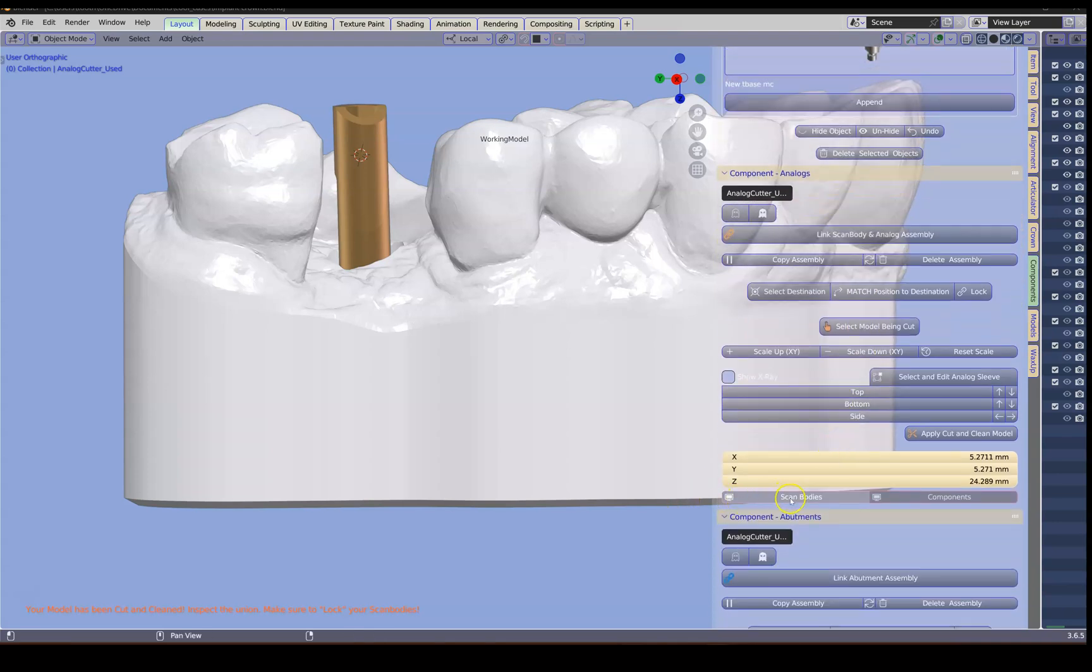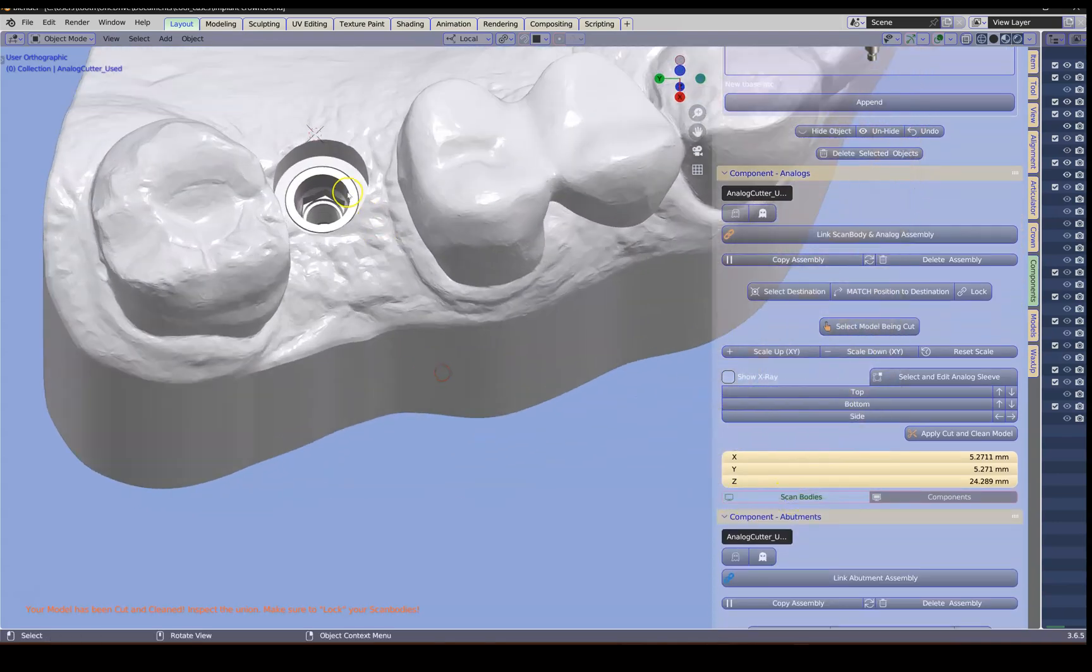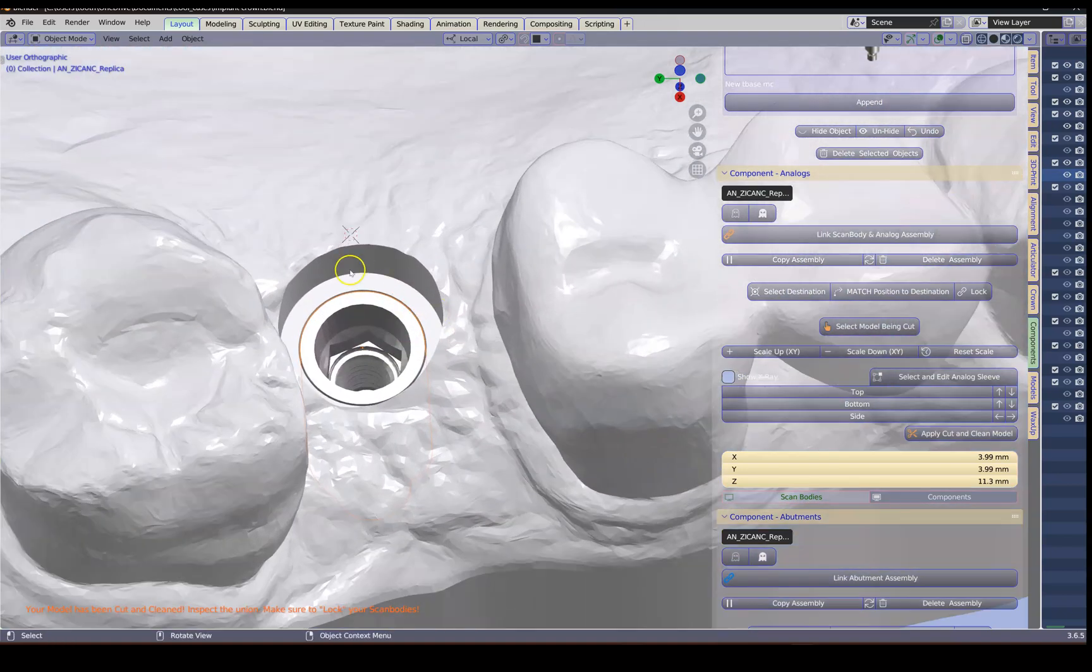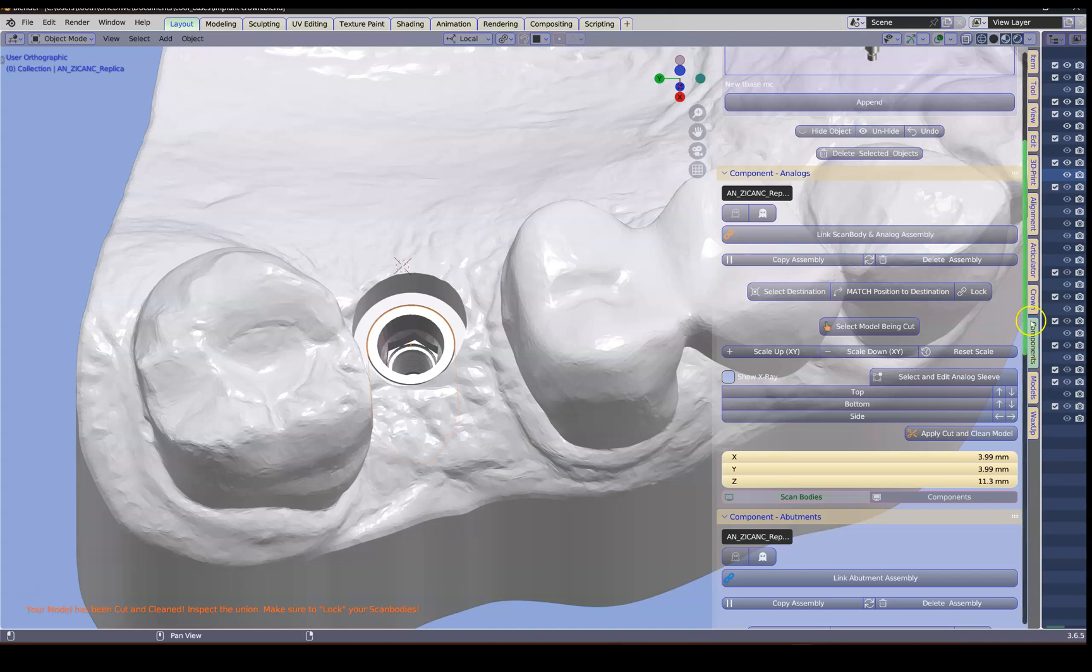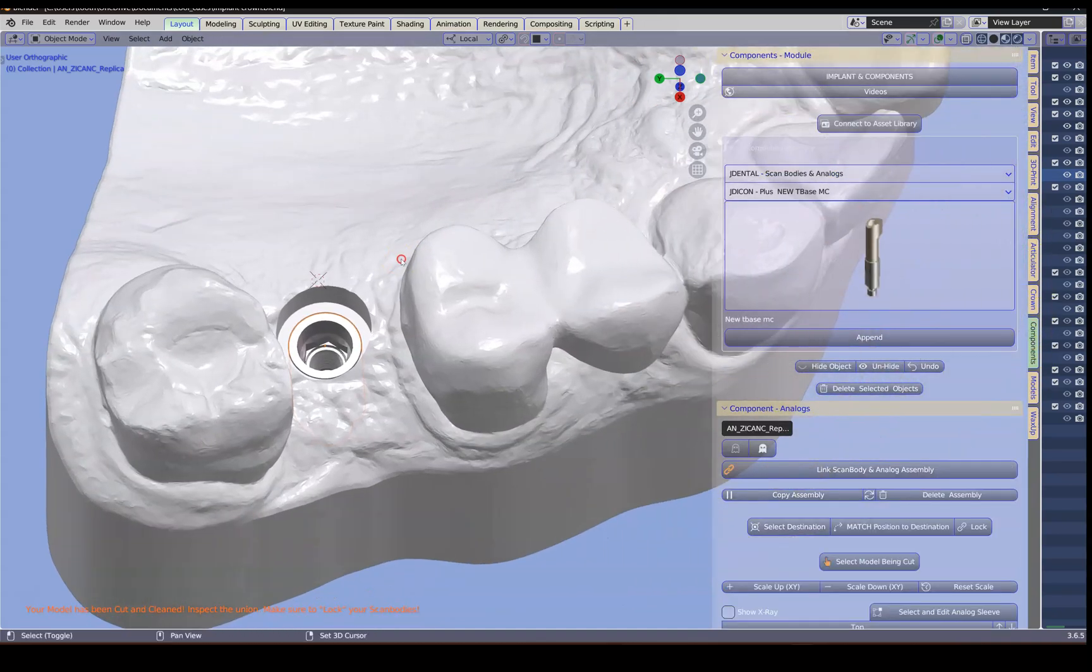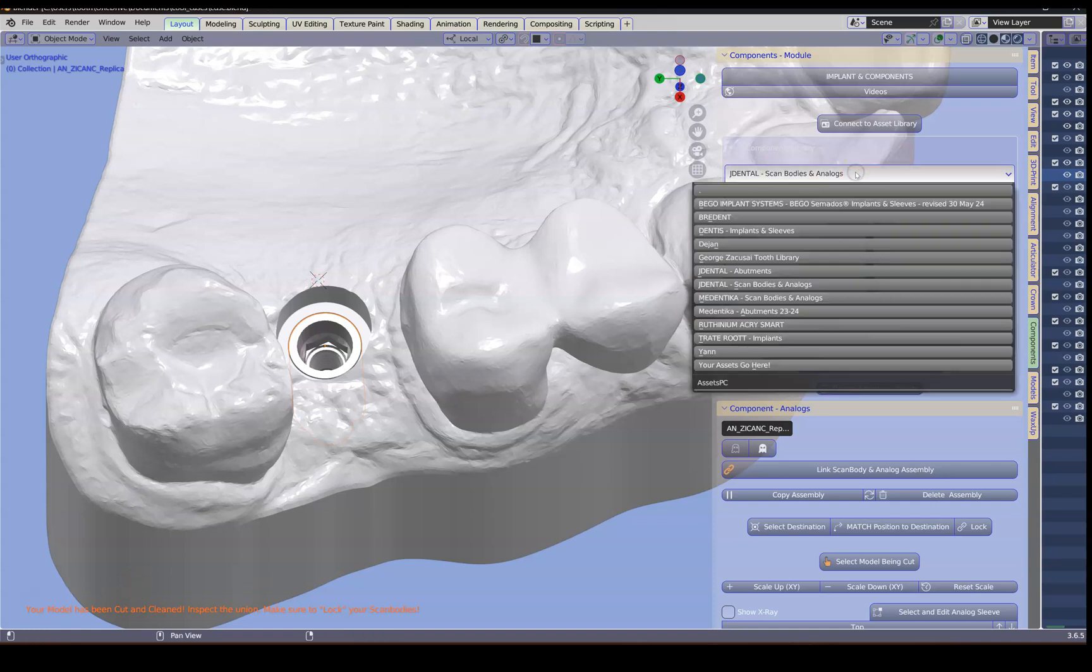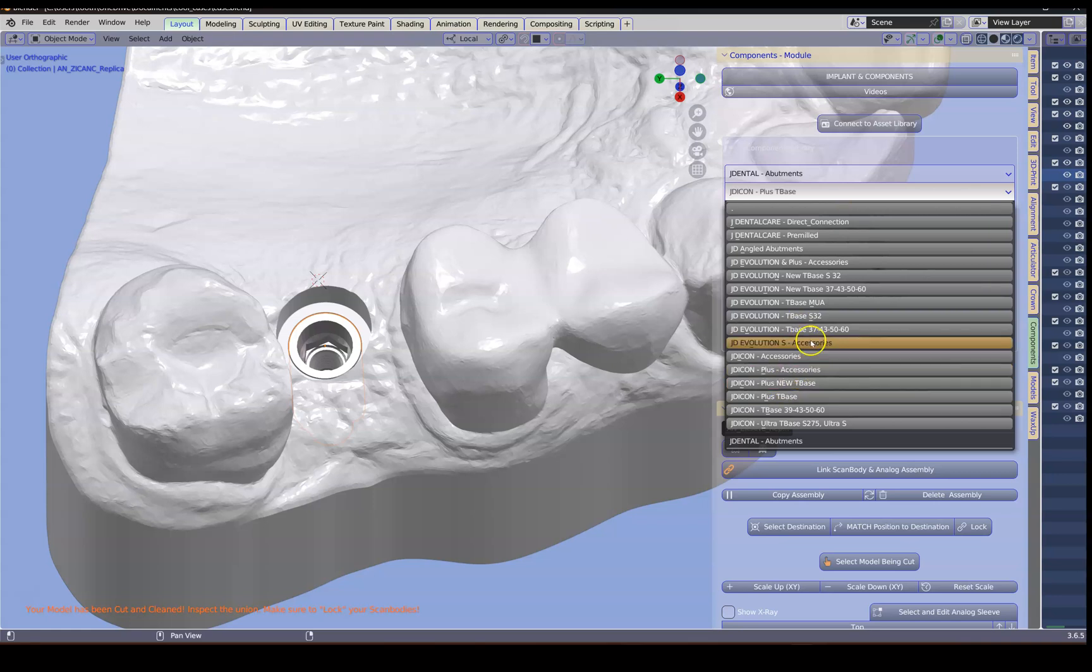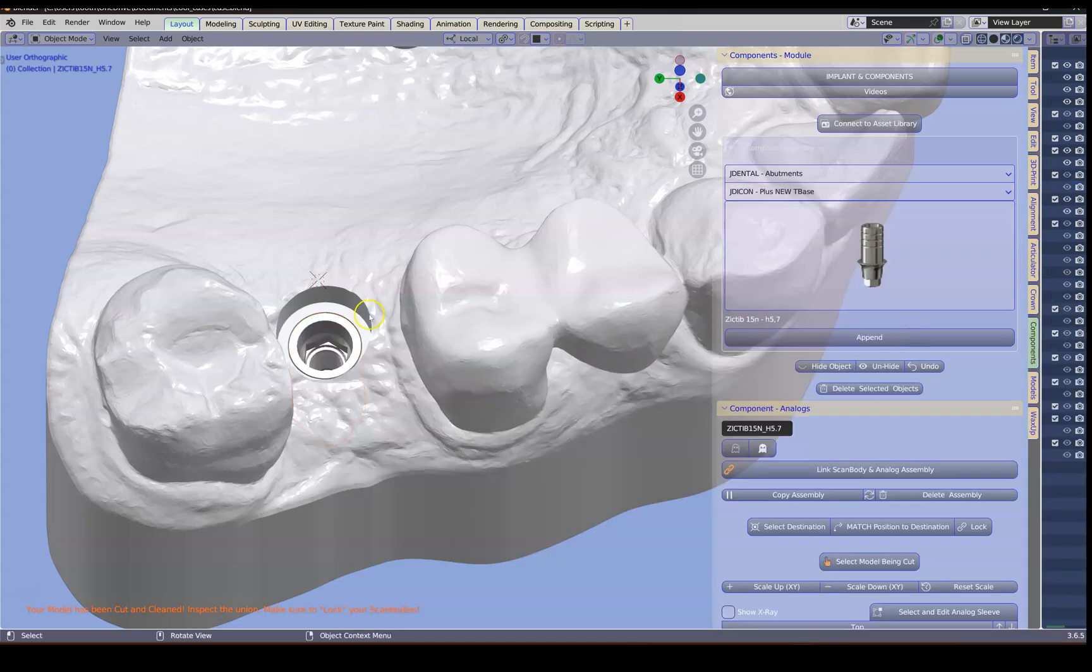So I'm going to hide the scan body. And this is my little analog which fits into the model. We're going to go back to the components module and select our implant interface. Back to J Dental. This time we're going to go for the abutments. And we're going to choose our abutment.